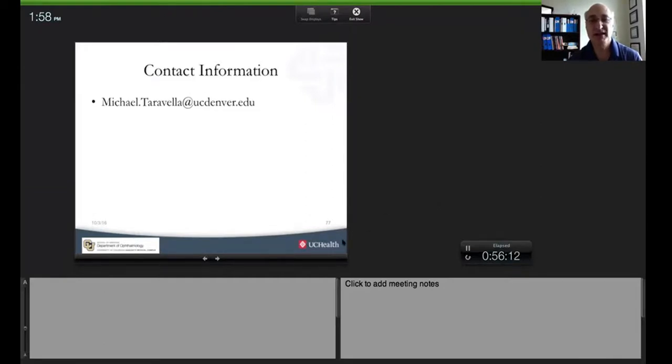Looks like all of you got that, so that's good. Glad to see you're all paying attention. A thin, compact graft with less than 3 diopters of astigmatism and improvement of visual acuity of 2 or more lines, which is kind of a modest definition of success if you think about it. With endothelial keratoplasty, many times with Fuchs dystrophy, we can obtain 20/20 vision. But again, for penetrating keratoplasty, a little bit more modest in terms of success.